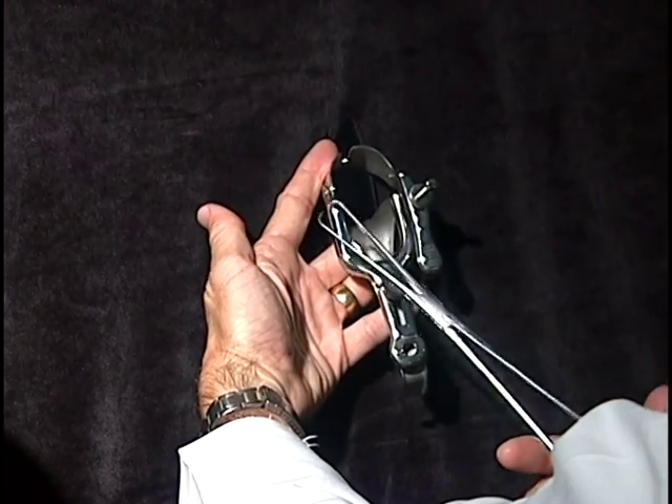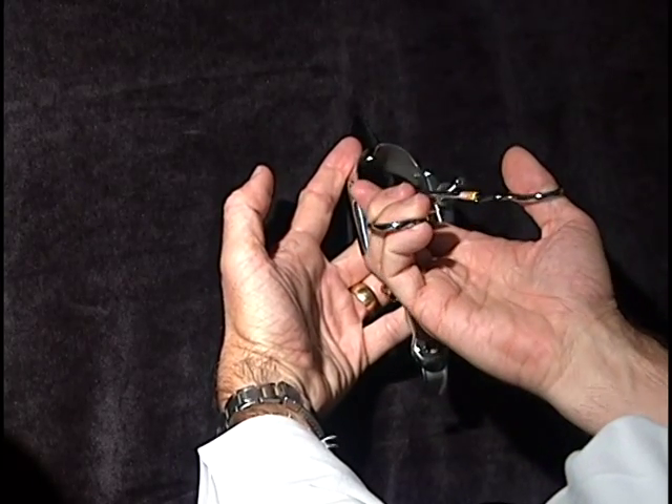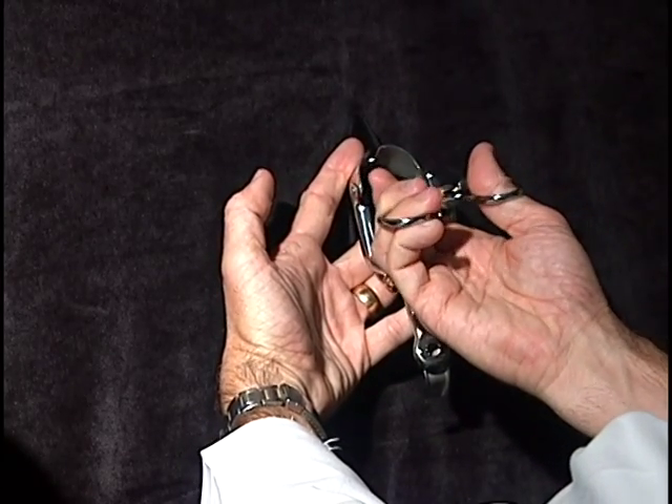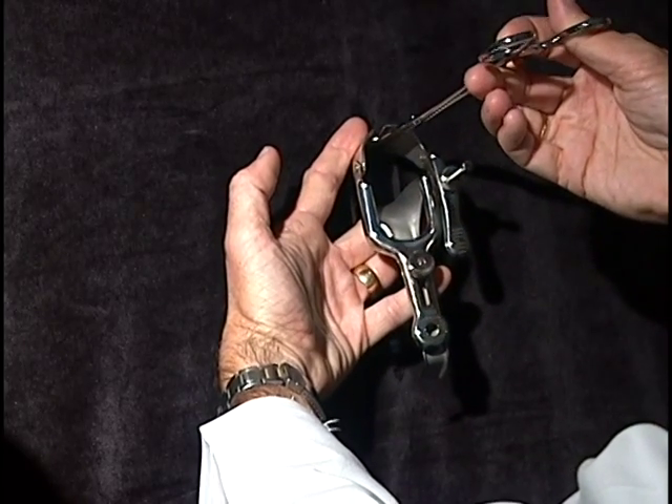This is a single tooth tenaculum. You can see the points at the end — they're sharp. This would be placed to the inside, and the cervix would then be grabbed, held, and controlled.